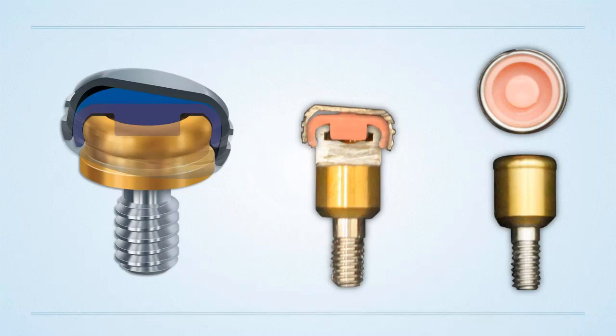That's to be expected. What happens is that this movement needs to be transferred to the implant somehow. When that movement occurs on the outside part of that nylon insert, you're going to minimize the wear to the retentive part of the insert, which is inside here. In some other attachment systems where you don't have that pivot, you could rapidly accelerate wear of your nylon inserts.